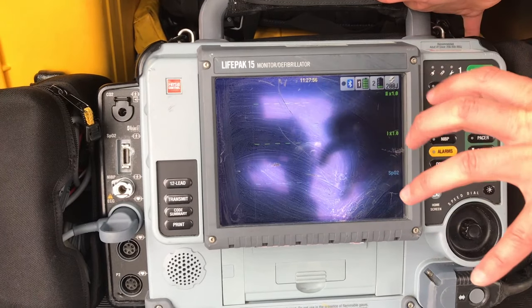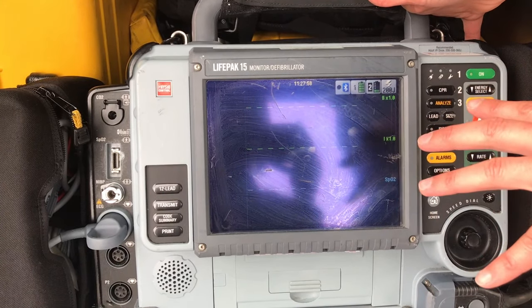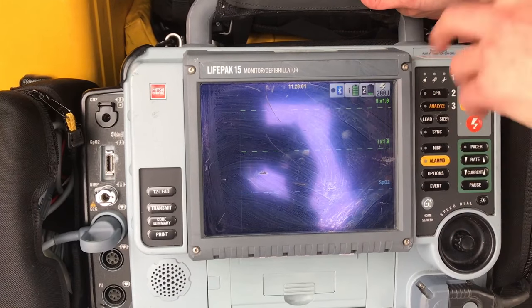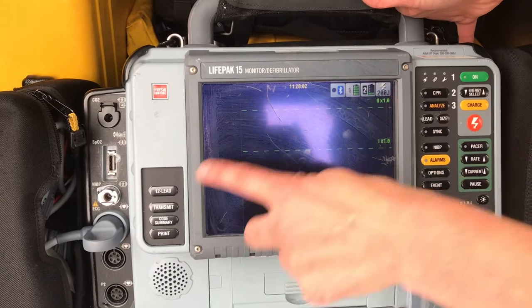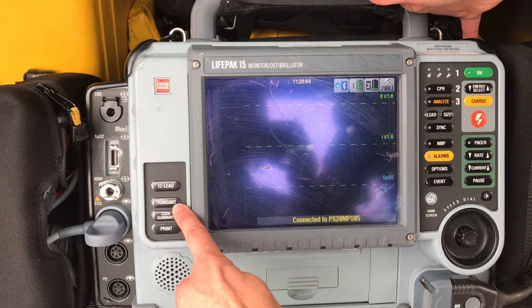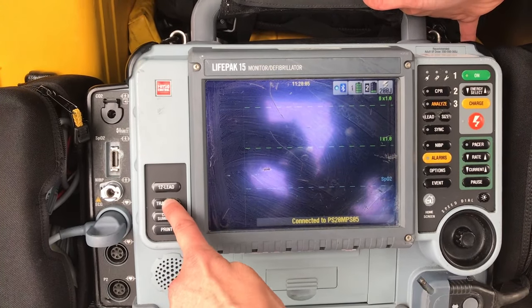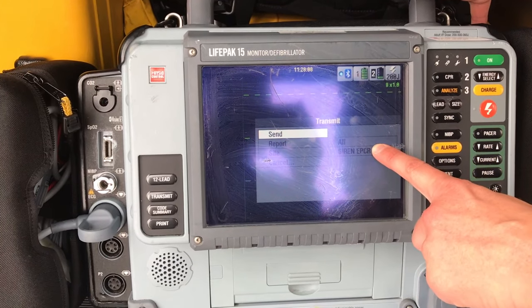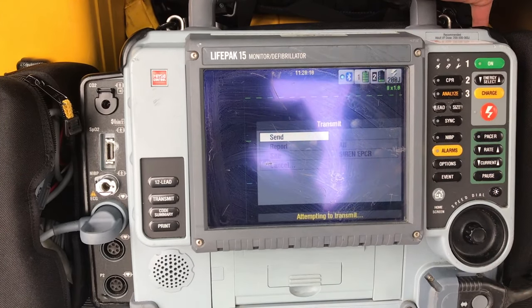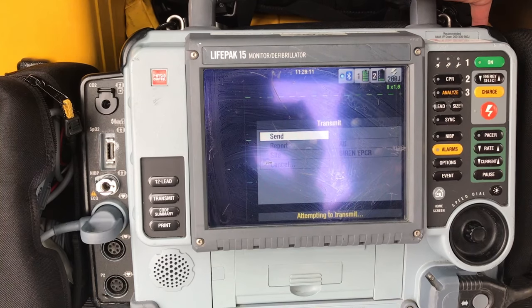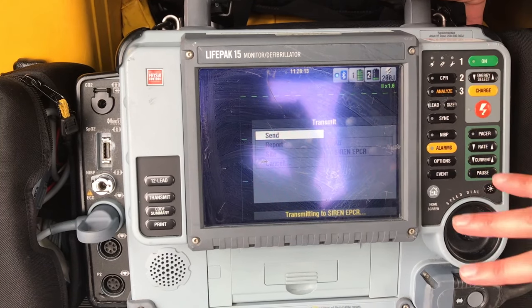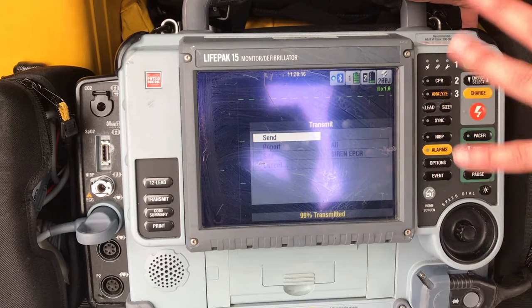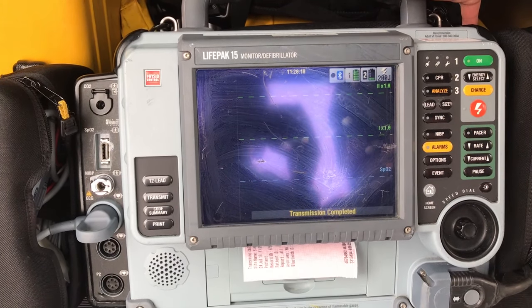Let's say you just finished a call and you want to transmit the information from your LP15 to your Siren. All you need to do is go over to the side, hit Transmit. The default site will be Siren ePCR. Press send, and it will transmit all your vital signs, your ECGs, and your 12-leads into your Siren.